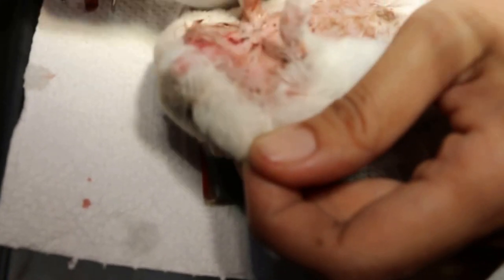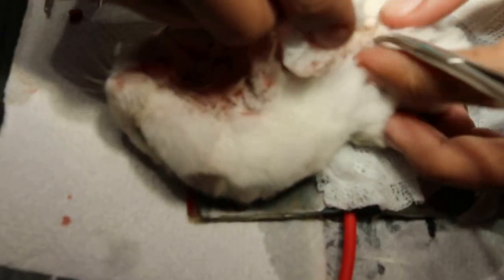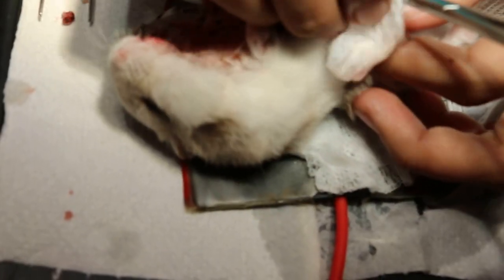Quickly, more than that, faster than that, because there's a short time. This hamster cannot take too much anesthetic. This is a sand gland, this is a belly button.